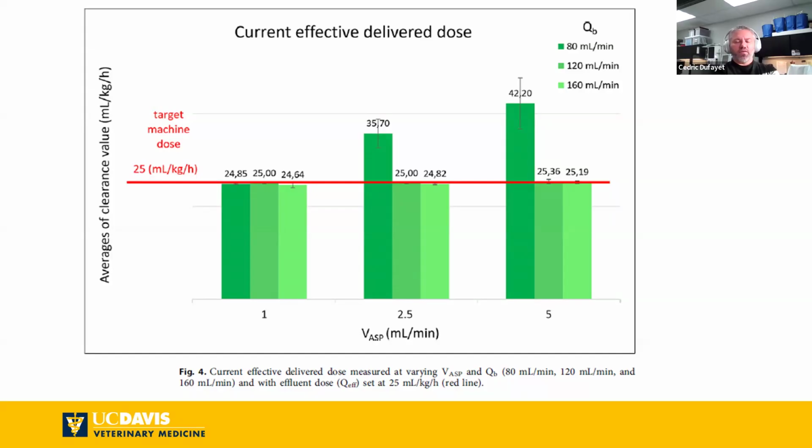And it seems like the safe aspiration velocity would be 1 ml per minute, which seems like watching paint dry. So it might be a little bit difficult, but I think it was kind of eye-opening and might actually bring some answers to that question, like what is happening with my Carpe Diem? Why do I have a higher BUN concentration post-filter than pre-filter?